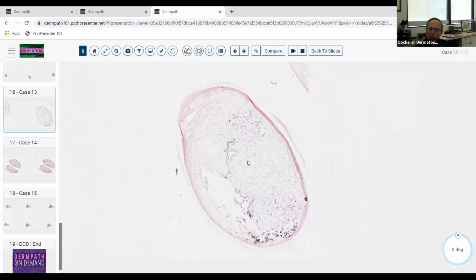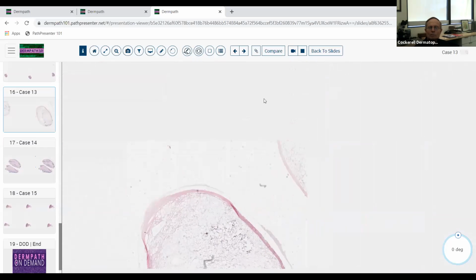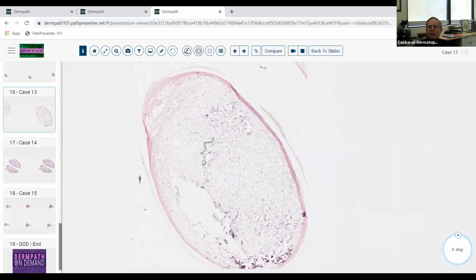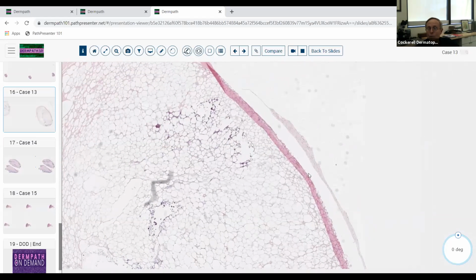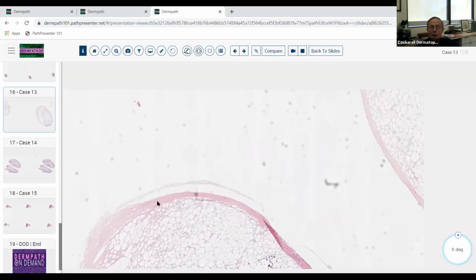But what's a little different about this type of lipoma than most of the other lipomas that we see in the clinic every day? Do most lipomas pop out like a little marble in the skin or a BB? No. So this is a subtype of a lipoma. It's known as a mobile encapsulated lipoma. It's encapsulated because it's got this little fibrous rim at the periphery. Whether it's a real capsule or just the fibrotic dermis at the edge of it.